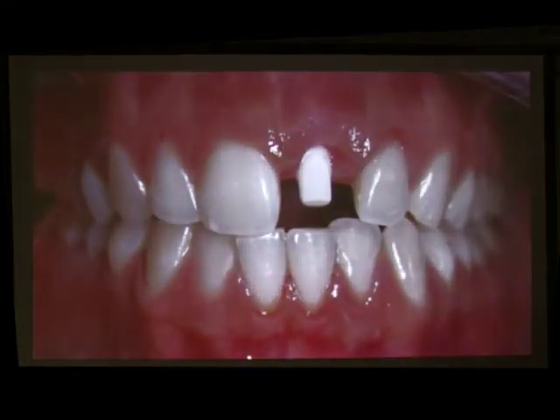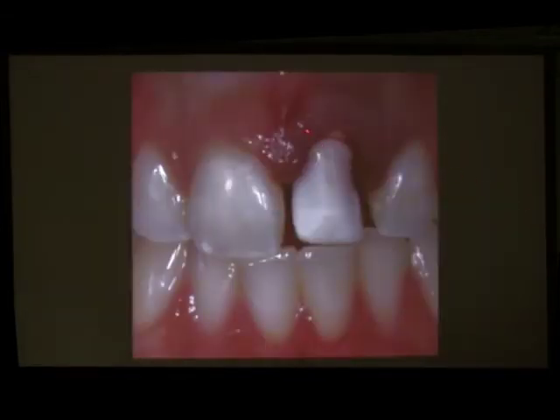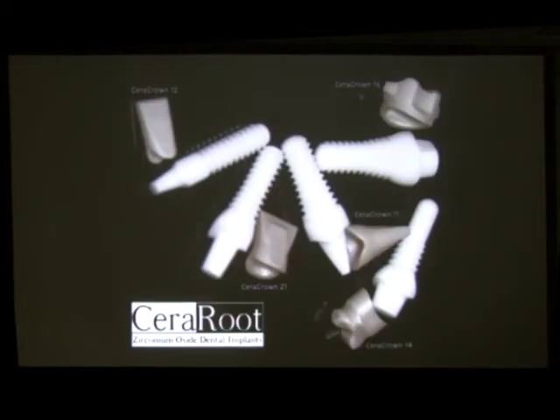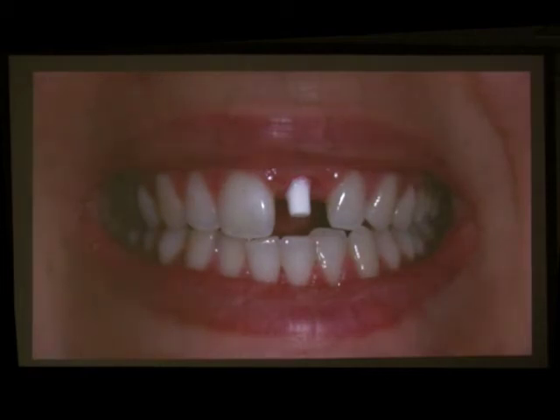If the patient wants a crown, for sure, we don't do the temporary crown up to here. Never. So if the patient wants a crown, we put the crown much lower. We don't know where the implant will heal, but the temporary crown is far away from the margin. So sometimes the patient leaves the office with the temporary crown not touching the gum. In no case do we put the temporary crown to the gum, to the shoulder during healing time.